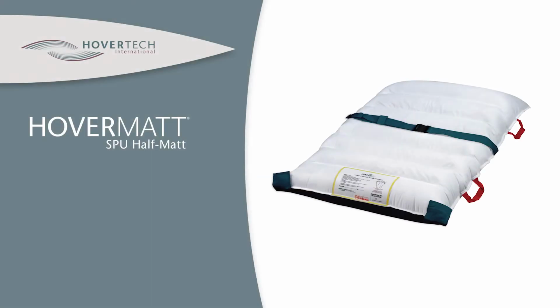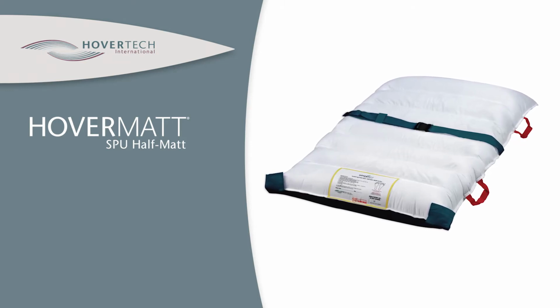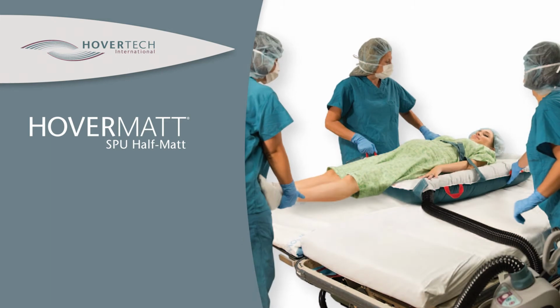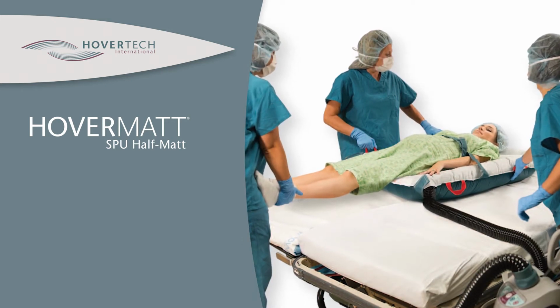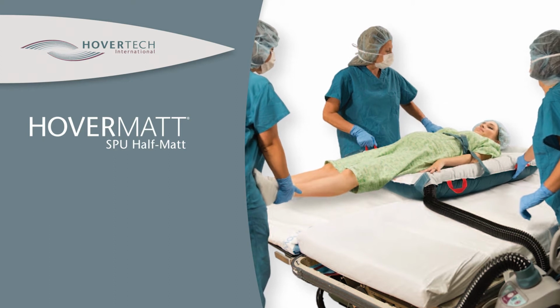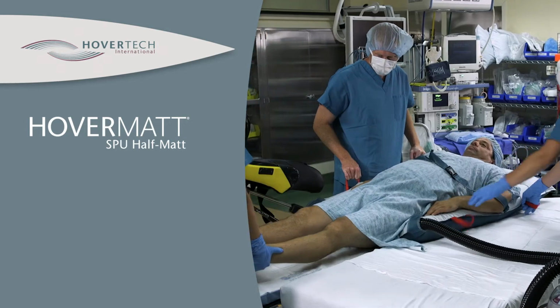The HoverMatt Half-Matt is designed for use during surgical procedures in which the patient will be in the lithotomy position, such as OBGYN or urologic procedures. You should have at least 3 caregivers present to assist with a half-mat transfer. This video will demonstrate a lateral transfer onto the OR table.